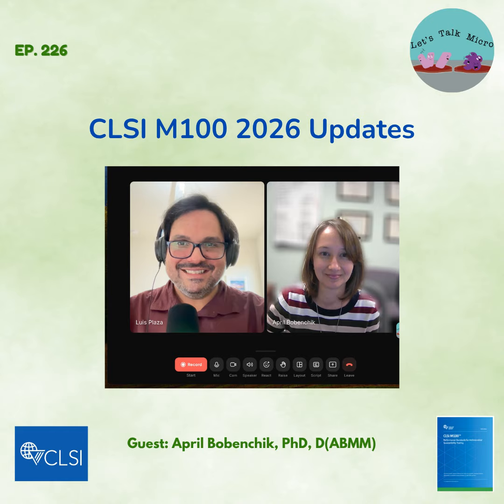Okay, so let's talk a little bit about quality control, right? When it comes to quality control, are there any updates in this edition that laboratories should be aware of? Nothing major. Like last year, we made major changes in frequency of testing or performing QC. This one, for a clinical lab, maybe the big change is we adjusted the imipenem QC range for integrity checks.